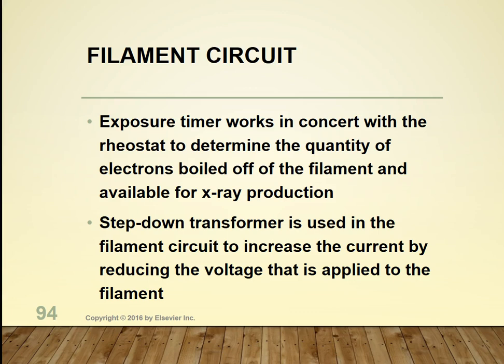So you remember in part 2 when I talked about the number of turns? So the number of turns and your kV are always directly related. The number of turns and your current, and the number of turns and your resistance, are always inversely related. Okay, so keep those in mind. That's why I went through the electricity part before we got to here.